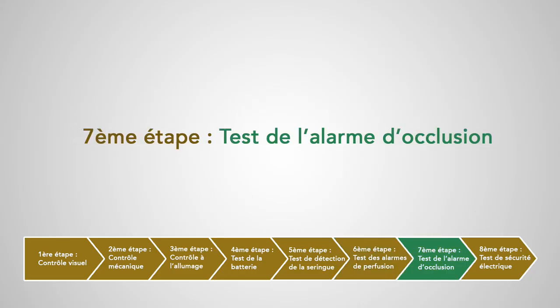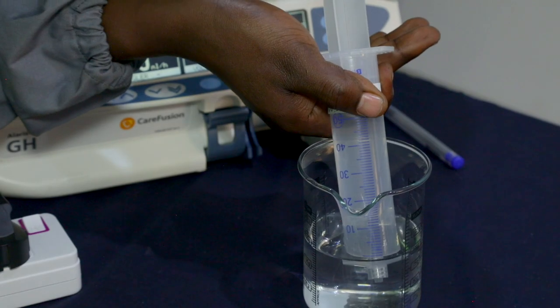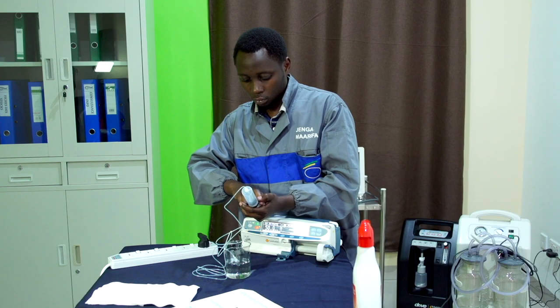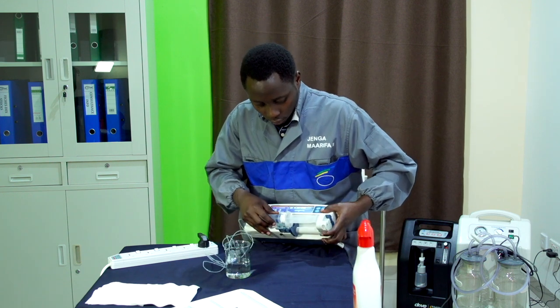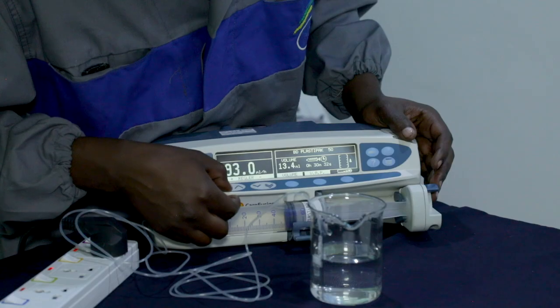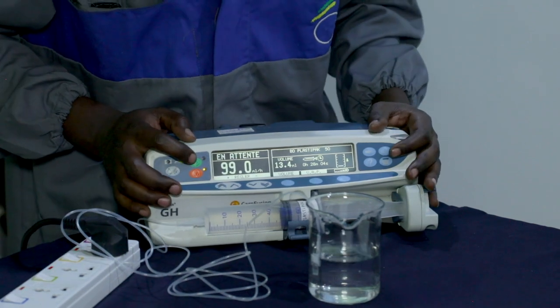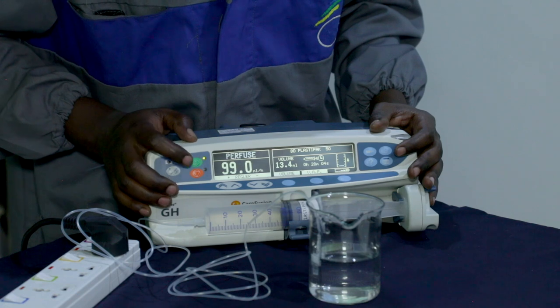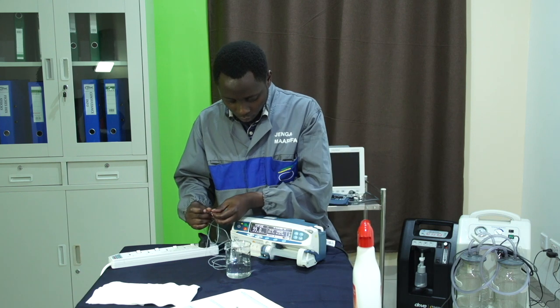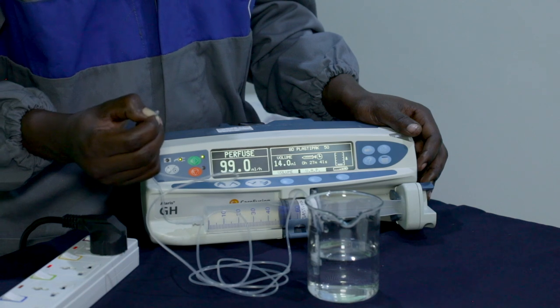Septième étape : test d'occlusion. On va remplir la seringue d'eau, connecter le prolongateur à la seringue, éliminer les bulles d'air et insérer la seringue sur notre pousse-seringue. On règle le débit des perfusions à 99 ml par heure et on démarre la perfusion. On va boucher le prolongateur pour simuler une occlusion, on attend un peu et on vérifie qu'une alarme retentit et que la perfusion est stoppée.